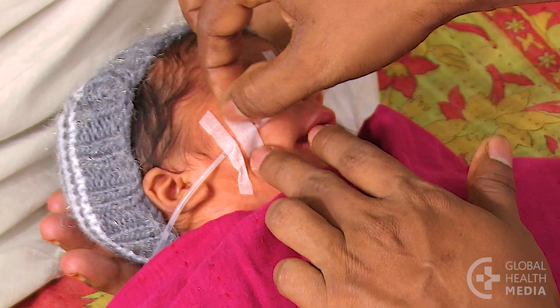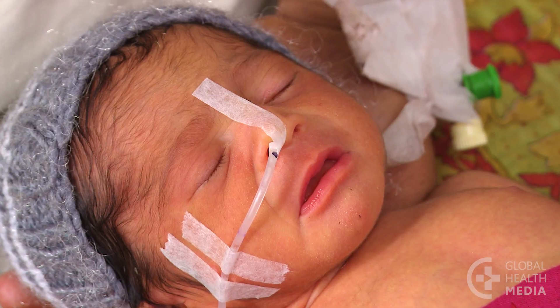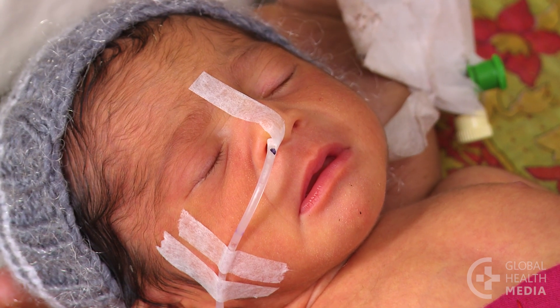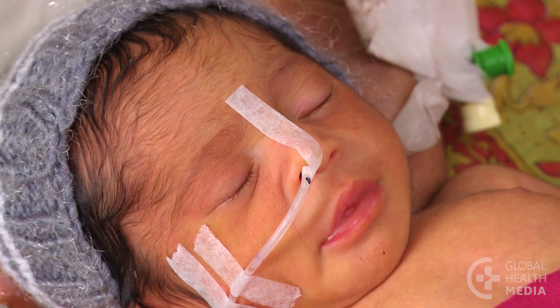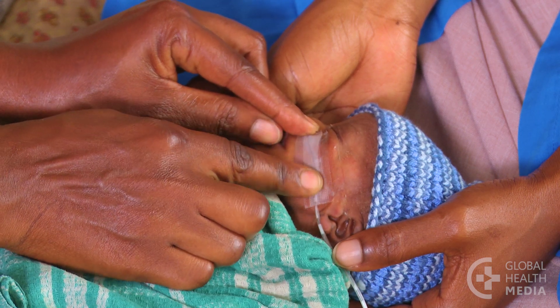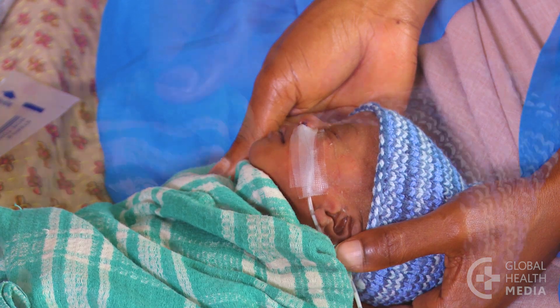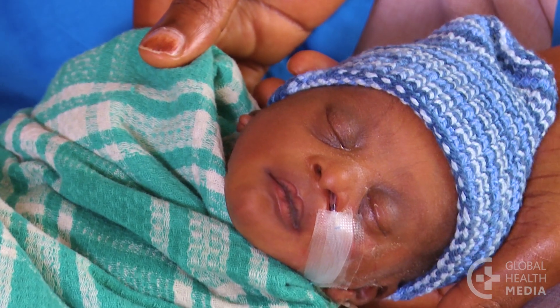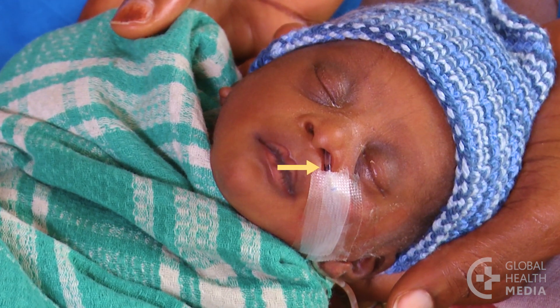Be sure the tape sticks to the tube to avoid it sliding around beneath the tape. Your mark should be visible near the nose. An alternate taping method keeps the tube secure without pulling on the nostril. Note that the mark is left visible to easily check for placement before each feed.